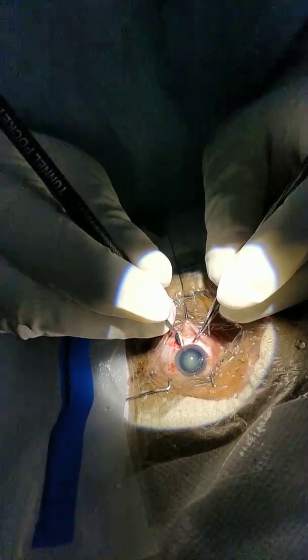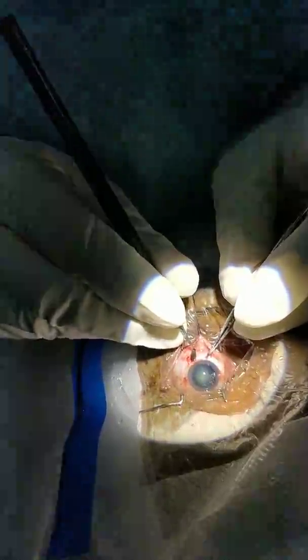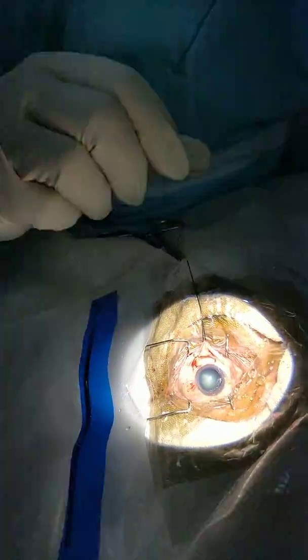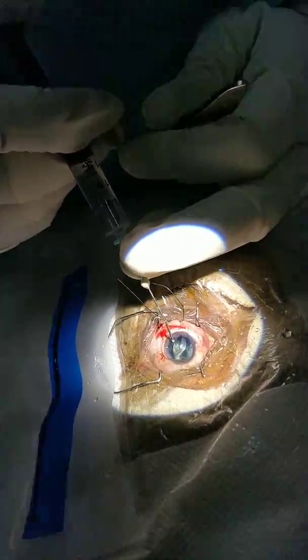Before, because of ECCE, there was a need for suturing. Now there is no need for any sutures. The tunnel I did is a triplanar tunnel and it is self-limiting, self-sealing.